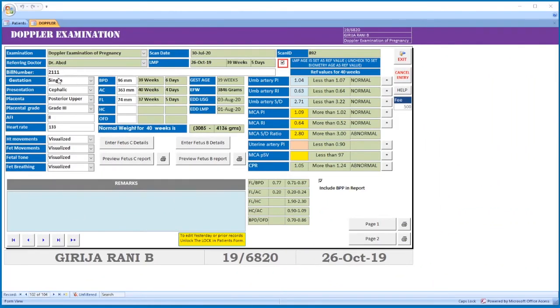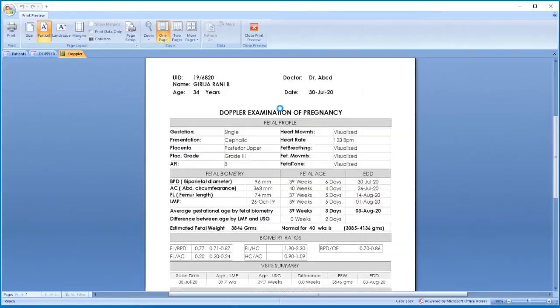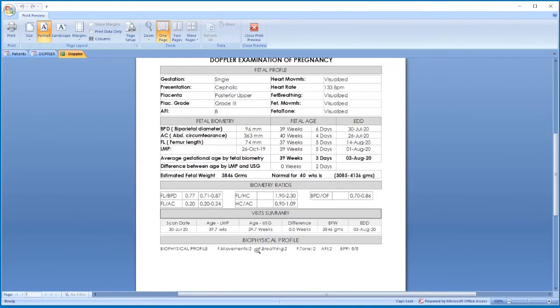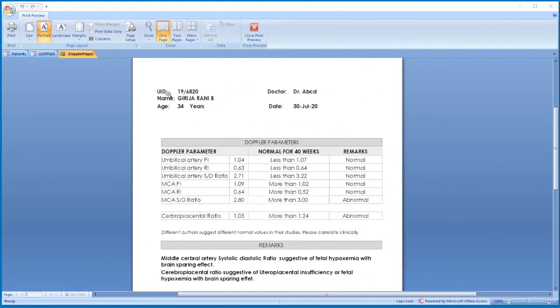Page 2 shows patient details and fetal anatomy. If it is a doppler examination, enter the patient's fetal profile, then BPD, AC, and FL. Enter the umbilical artery PI, RI, and S/D ratio, MCA PI, RI, and S/D ratio. Print — this is the page 1 printout showing patient details, fetal profile, fetal biometry, fetal biometry ratios, visit summary, and biophysical profile. Page 2 shows the doppler parameters entered and the corresponding normal values.